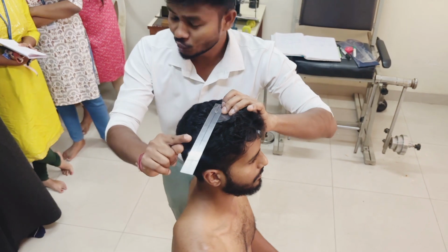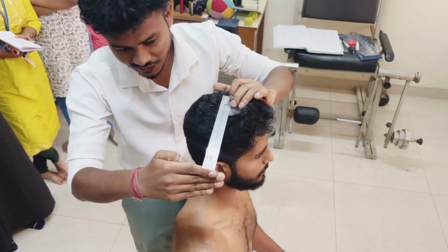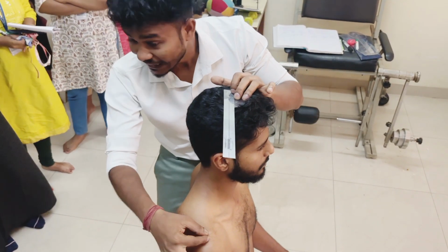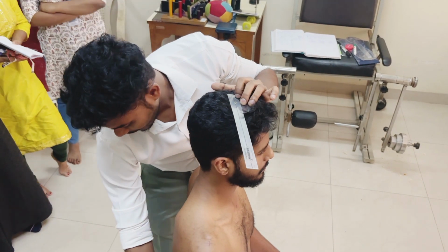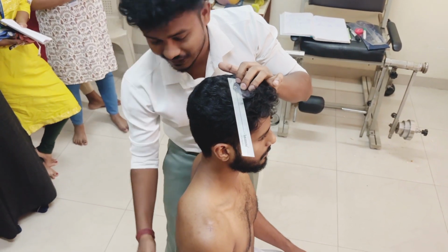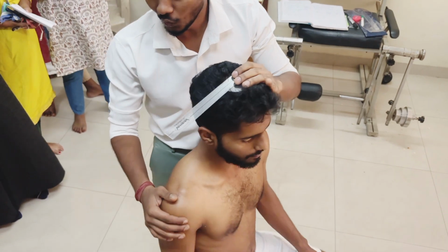The stable arm will be on the same place, coming exactly to the acromion process. The point is, this acromion process is exactly above the iliac crest. Understand? Then we ask the patient to do rotation.